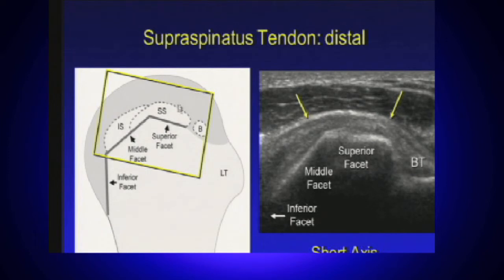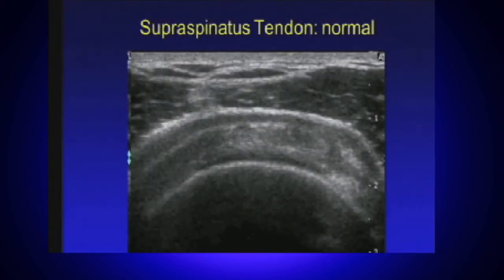So in younger people, you'll have a tear here. In older people, it tends to occur near the apex or even over here. Note how the infraspinatus comes over the top, which is right like this. So these bone facets allow us to distinguish the supra from infraspinatus.